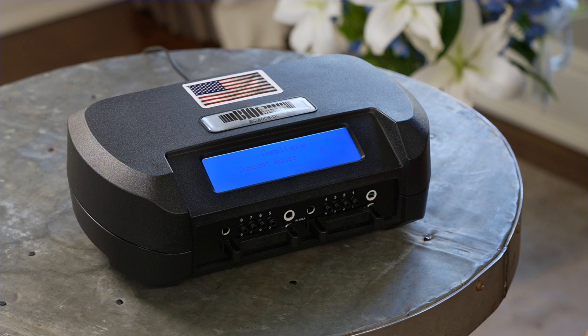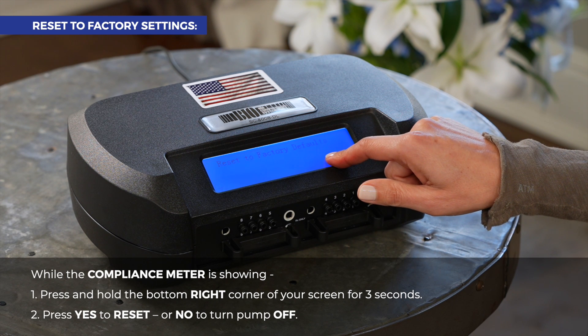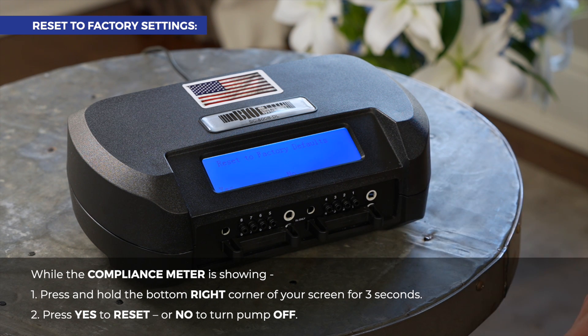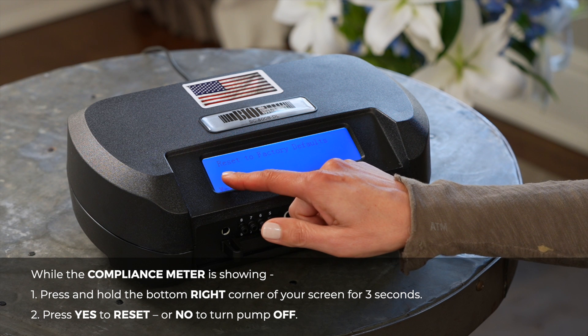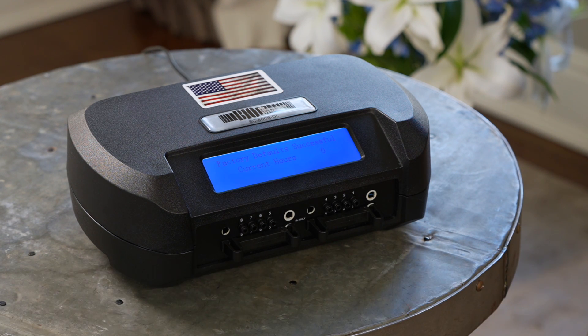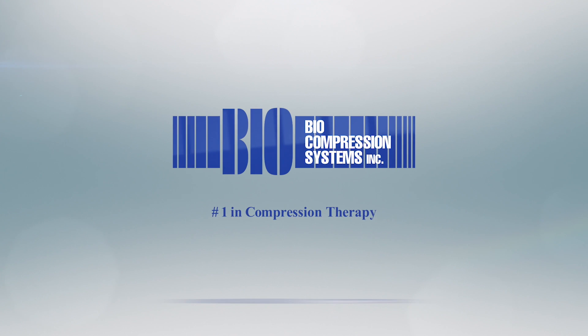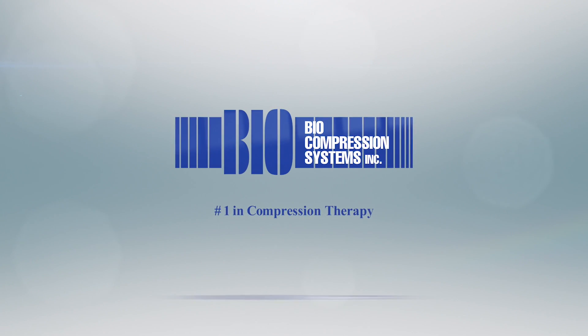If you ever need to reset your pump back to the factory settings, while the compliance meter is showing, press and hold the bottom right corner of your screen for three seconds. A message will appear: reset to factory defaults. Press yes to reset or no to turn the pump off. Thank you for choosing Biocompression. We hope to improve your quality of life starting today. Should you have further questions, please contact your local provider.